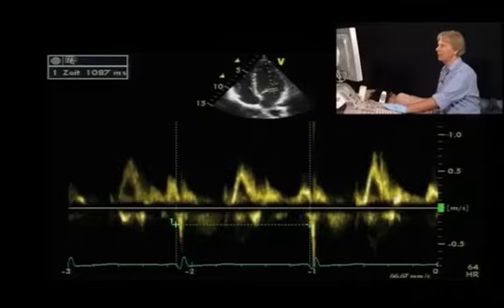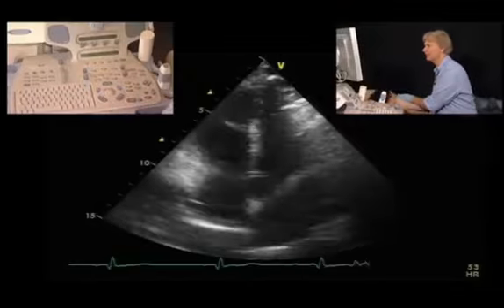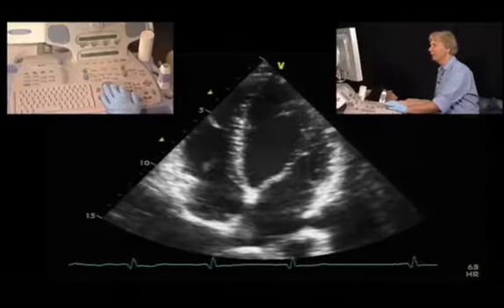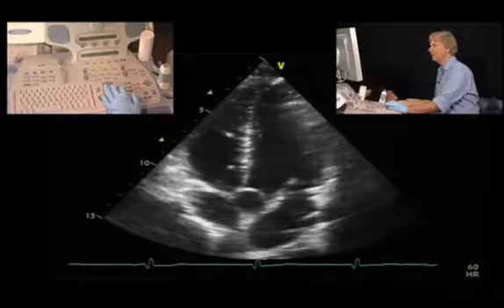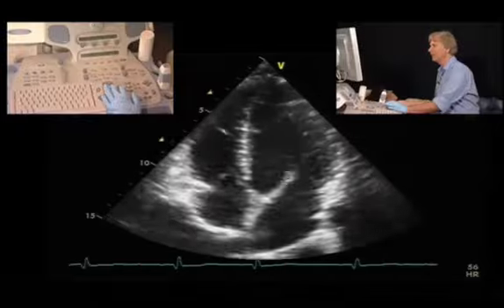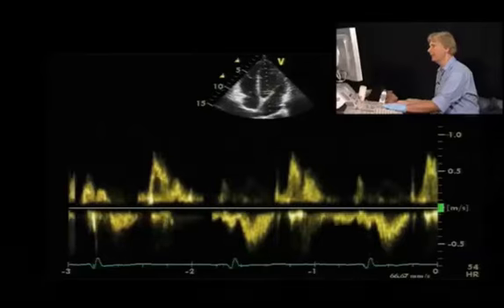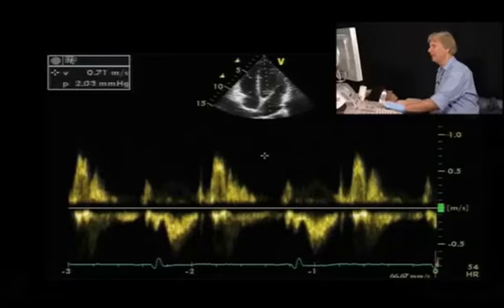The next thing that you can measure in such patients is the isovolumetric relaxation time. To do that, you need to also get an LVOT outflow signal, and to do that you need either a 5-chamber view or a 3-chamber view where you can see the LVOT. And then you place the signal right here in the LVOT, close to the mitral valve, and then you have both signals.